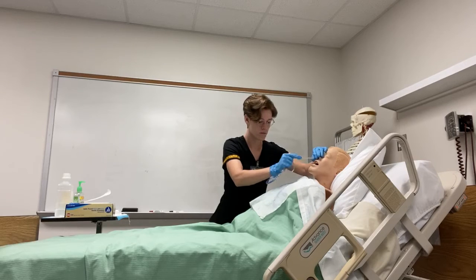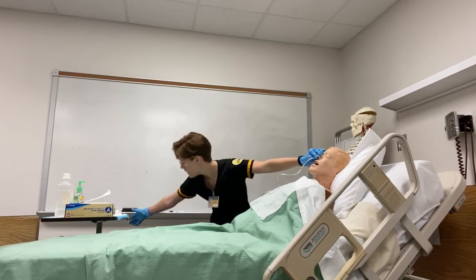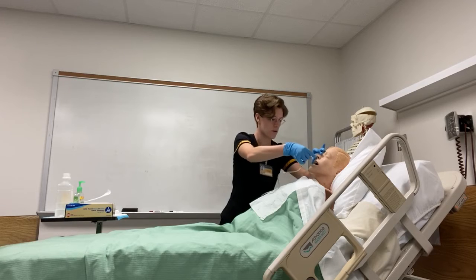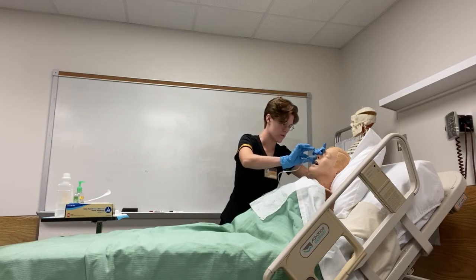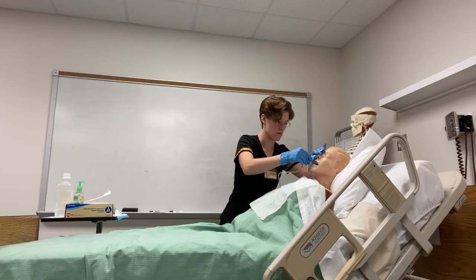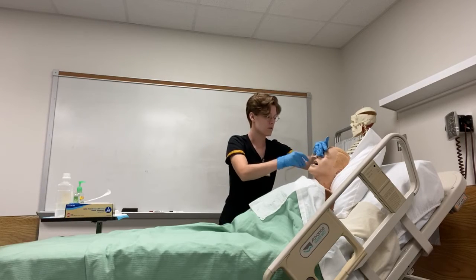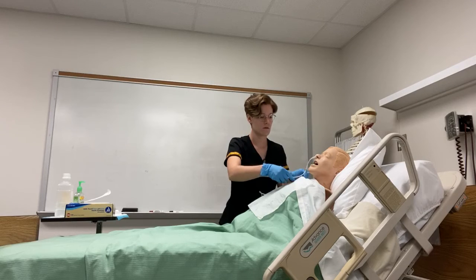All right, and now that I've reached my mark, I can let go of the rest of the tubing. I can grab my tape. I'm going to tape it to the patient's nose and make sure everything is secure. I'm going to wrap the tape around. And at this time, I would also tape the tube to the side of the cheek and also pin it to their gown. That way it prevents the patient from really seeing the tube, aggravating them, and they won't be able to pull the tube out.